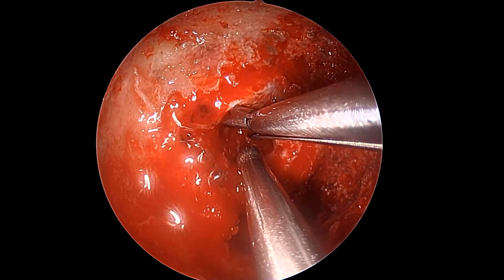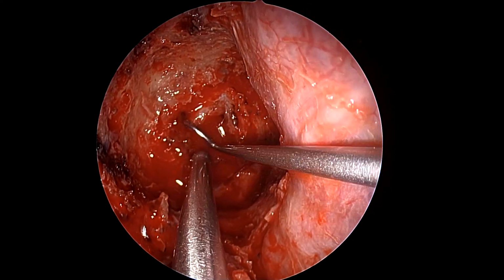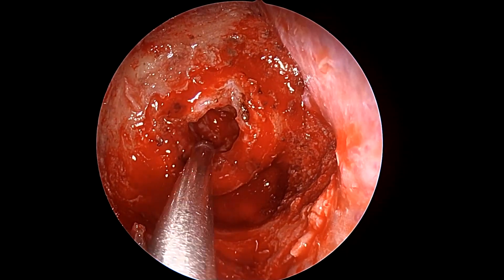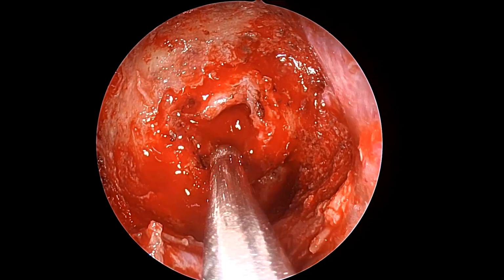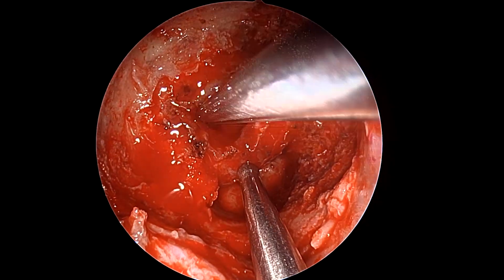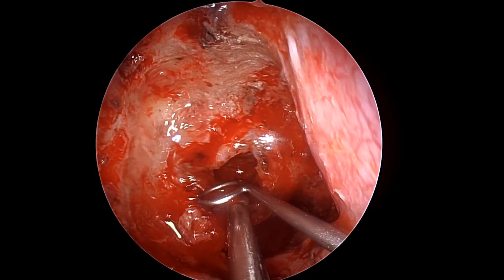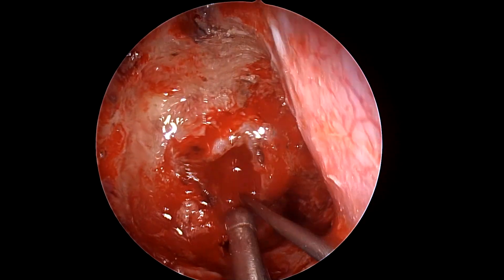Now, you see here we are again constantly pulling a very slight amount of tumor, and the amount of the tumor that we are pulling is basically the tumor that we are first dislocating from the use of the ring curette slowly and steadily, so that it's only the free lying tumor or the already dislocated tumor that we can remove and not pull anything that cannot be pulled, because then that obviously can lead to a catastrophic complication in this part of the body.